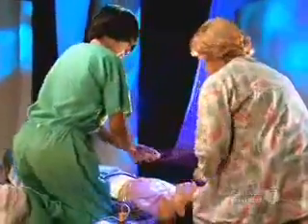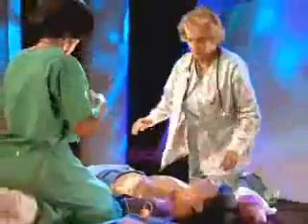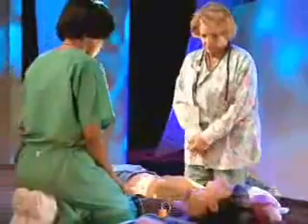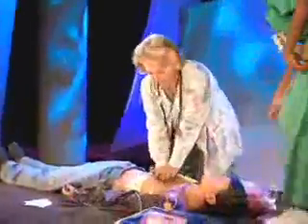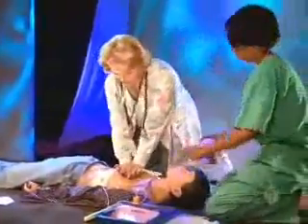Begin CPR. After five cycles of 30 compressions and two ventilations, pause for the AED to analyze. Analyzing heart rhythm. If indicated, press the shock button and switch rescuer roles. No shock advised. Begin CPR. Repeat this sequence of CPR and AED use until advanced life support providers take over or the victim starts to move. Now you know how to use an AED with two-rescuer CPR.